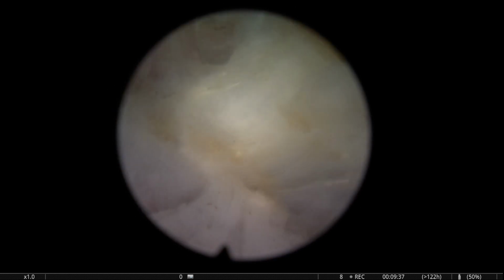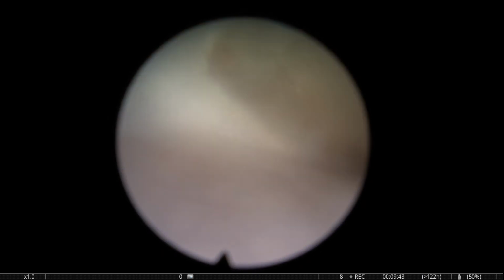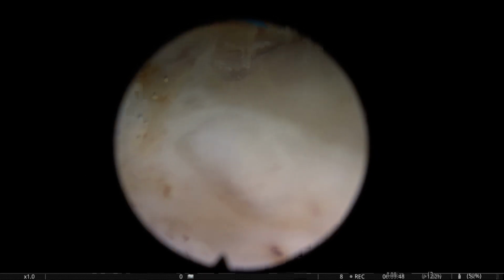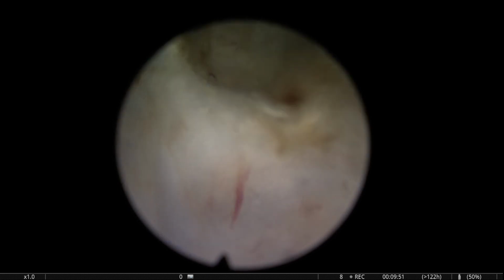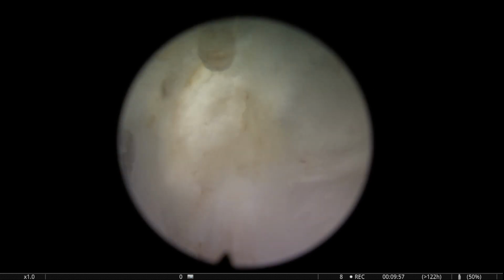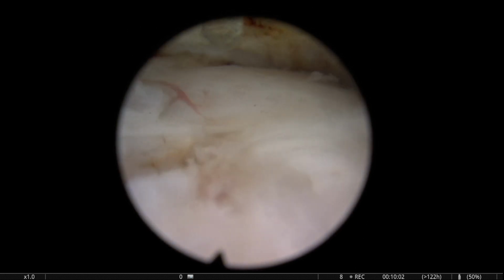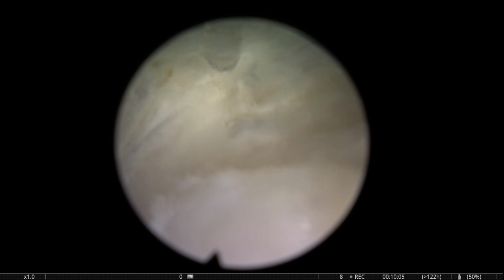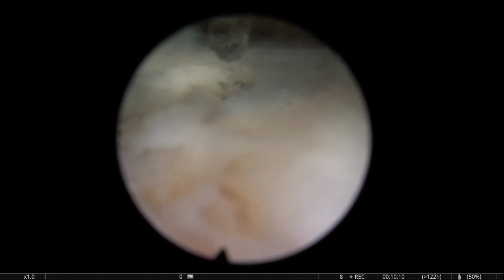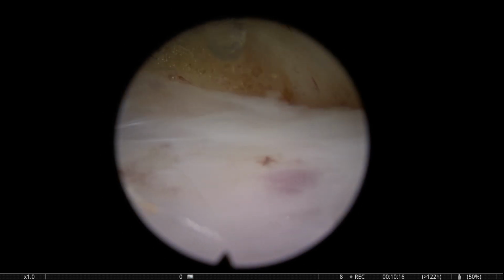So there's always room for correction, and you have to be ready to investigate. That's the fat I was mentioning. So probably that was going a little bit deep. So we will keep that in mind. Of course, if you see a small perforation, and this is the idea, if we're going to see a perforation, it has to be small. You know, the fiber measures 0.5 millimeter. So what we're going to do is to choose a little bit less depth, correct our dissection plane, and usually there is not so much danger in a very small perforation.